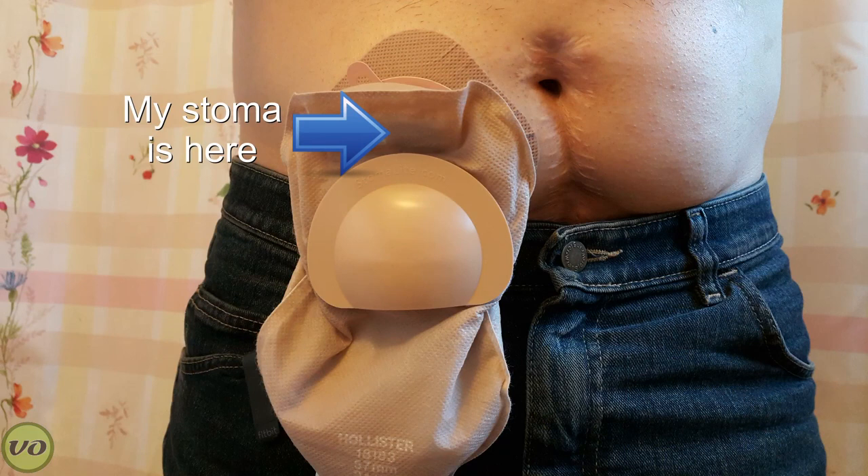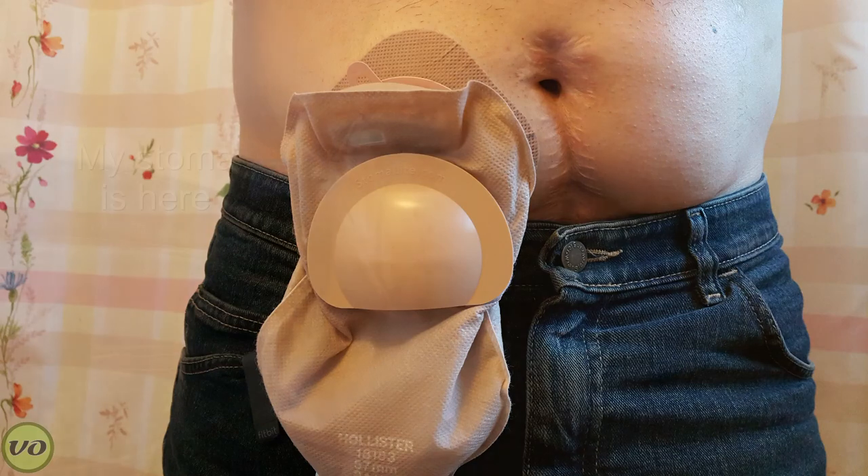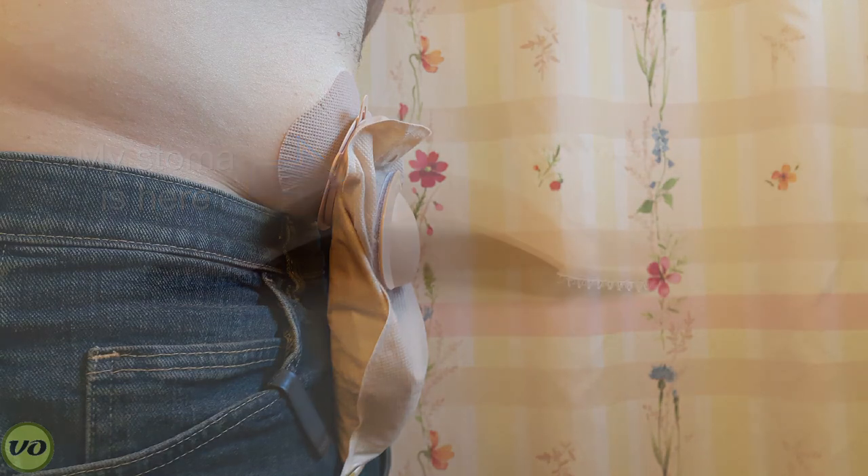Another thing is that as the pouch fills, I do notice that the guard will sag down along with the pouch, and for me that's a little worrisome because at that point it's not actually providing any protection at all. You do want to keep your pouch as empty as possible. With most other guards, they fill on the bottom while the rest of the guard stays on top because they're secured in place using some other method.